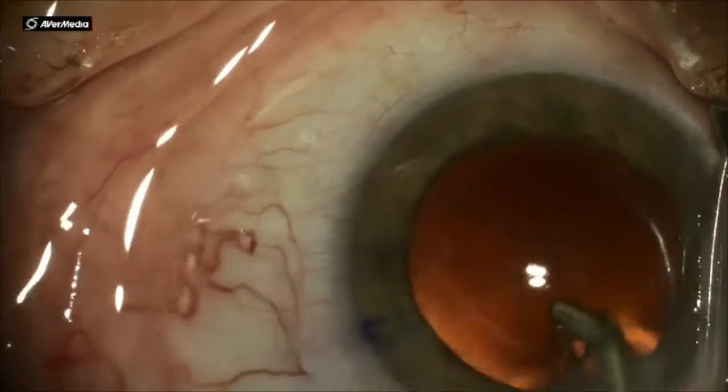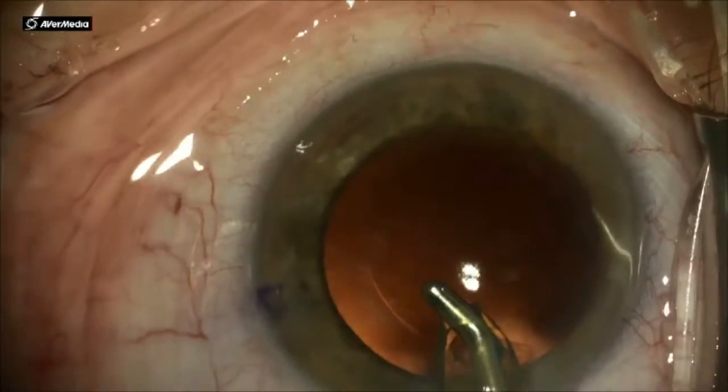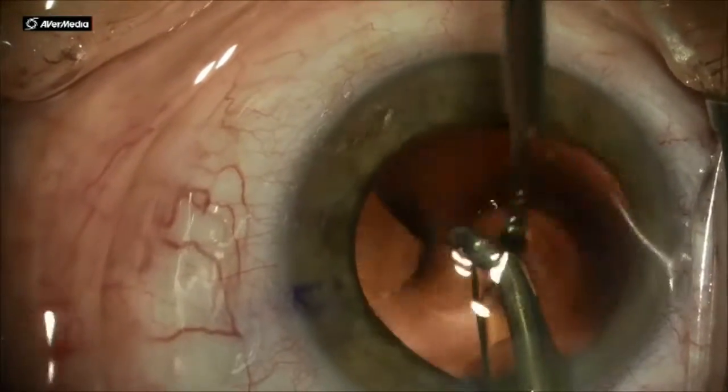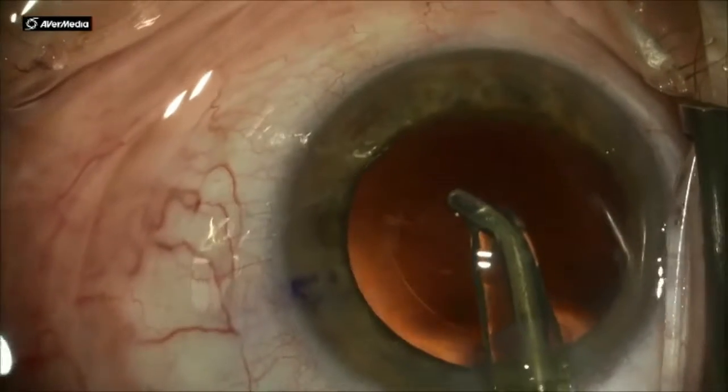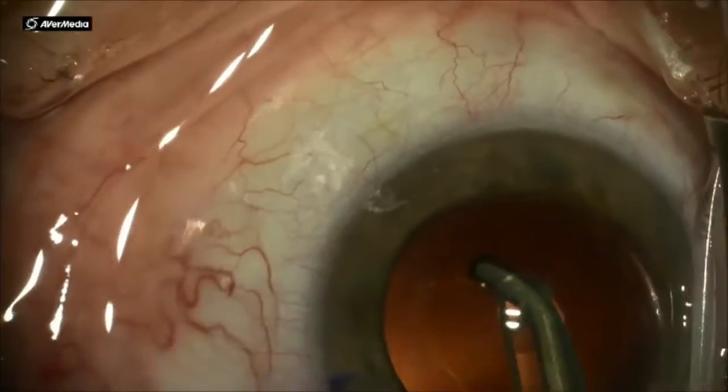I'm very gently tugging at it. You have to be very, very meticulous to not tear the anterior capsular edge, to not cause a capsular tear, and gently remove that sub-incisional cortex.